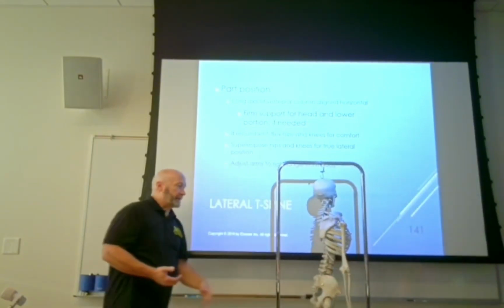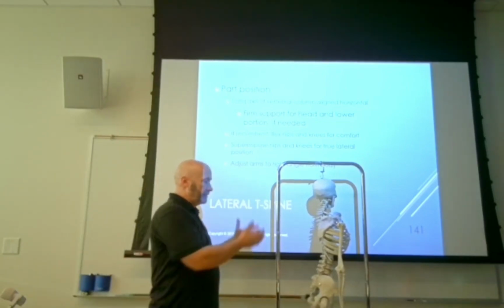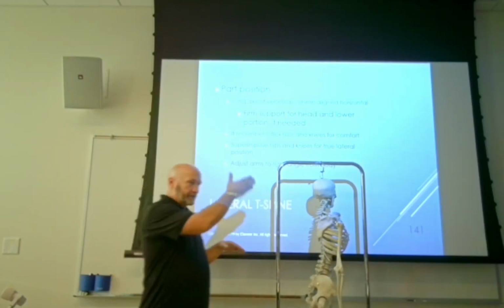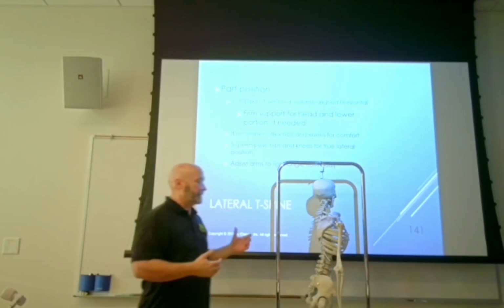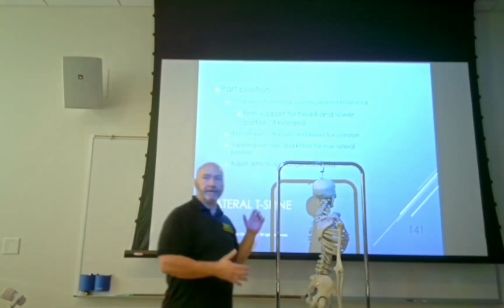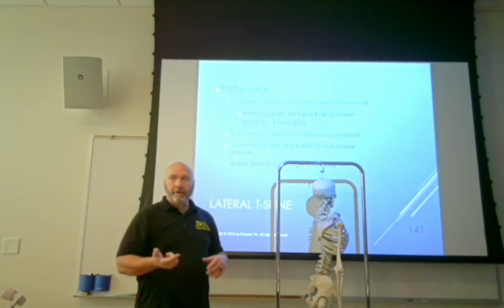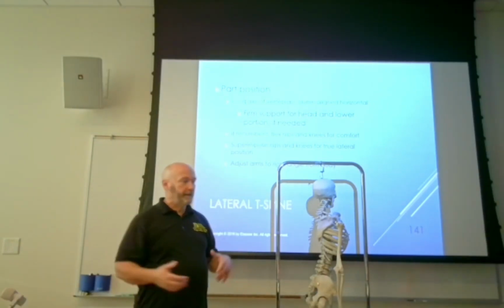So if you take a step back and look at the patient's spine, the divot in their spine, see if it's parallel. Sometimes it's going to have a little bit of a dip. The reason for that is, if a patient has a small waist and broad shoulders, you're going to have an angulation in your spine. It's more prominent most of the time in men because men tend to have broader shoulders than women.